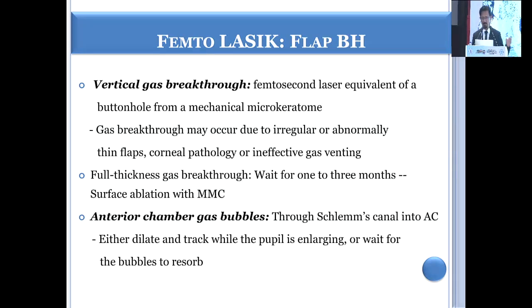But if it's a steep keratometry, then there is a chance of buttonhole, and that's why for any keratometry more than 46, I don't advocate using microkeratome, I would prefer doing a femtosecond laser. But even in femtosecond laser, you can have vertical gas breakthrough, and if that is the case, then that area remains uncut, and then we should avoid the surgery and do it at a later time.